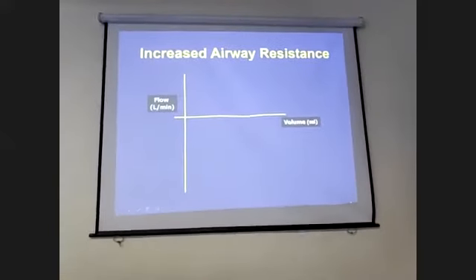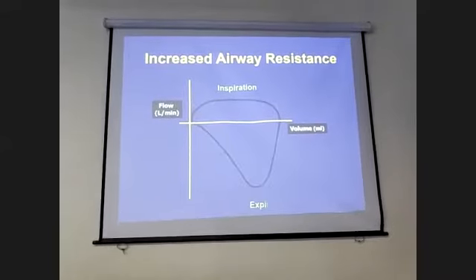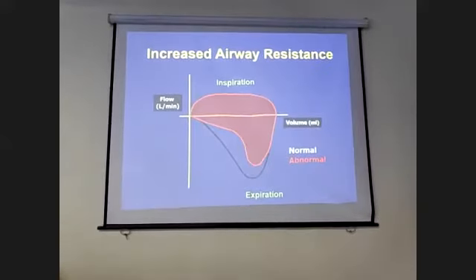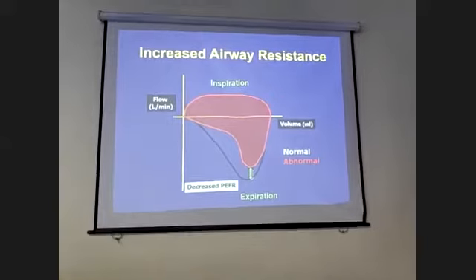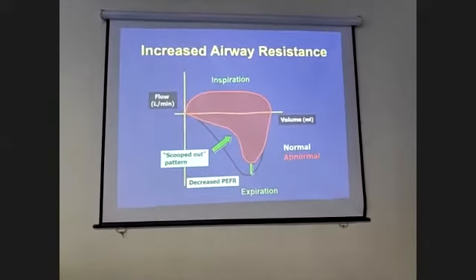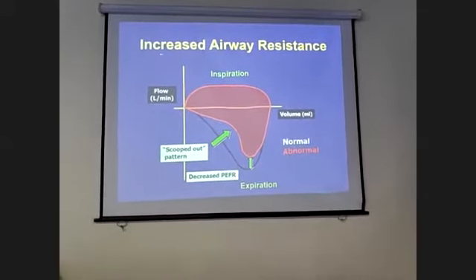The next is how to look at the compliance through one graph, although you can check it with other graphs also. Now I will be showing you how to check airway resistance through this graph. Okay, this is a flow volume loop. So what is happening?